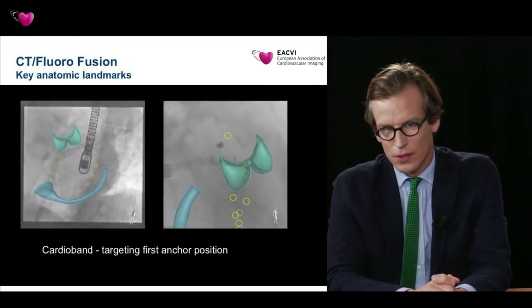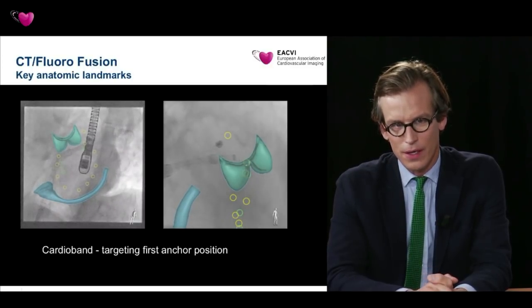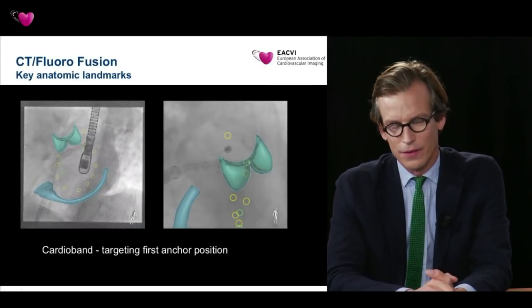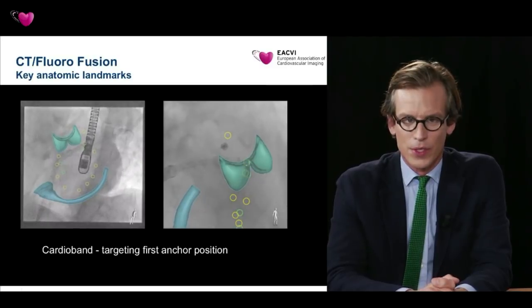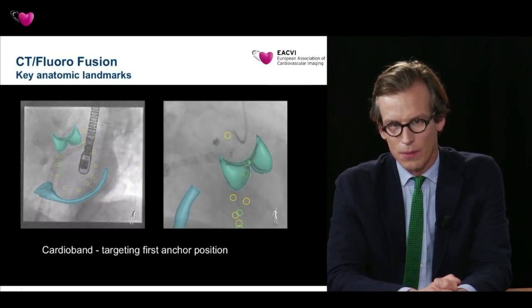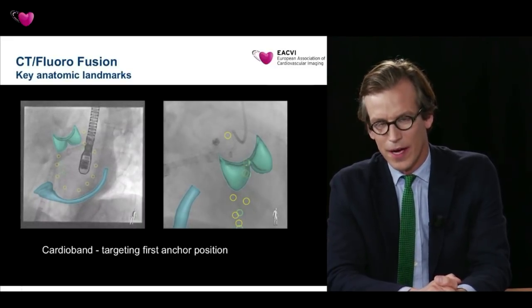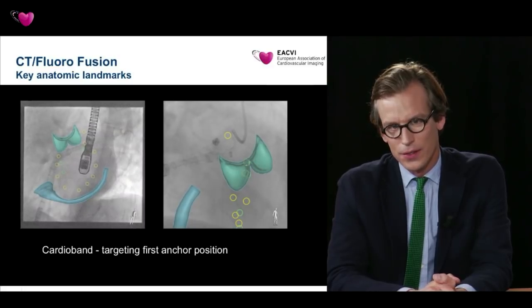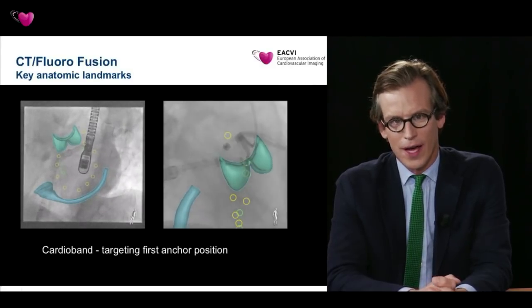What this looks like throughout the procedure I'm showing you here. You see the CT information overlay, you see the aortic valve and the coronary sinus, and you see our 10 markers which are defining the landing zone. What we also marked was the ostium of the coronary artery, and if you look at the right panel, you see the top yellow circle, and you see that the overlay with the coronary ostium is very well done, because you can see the coronary angiography.